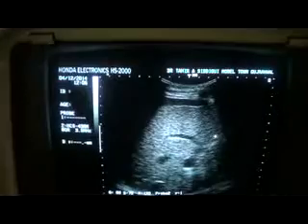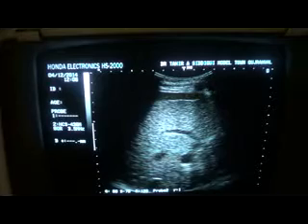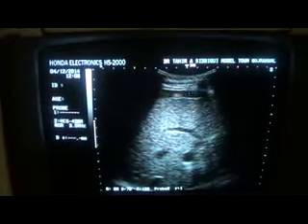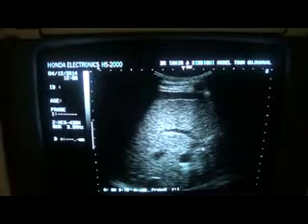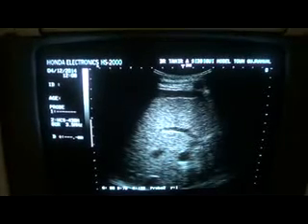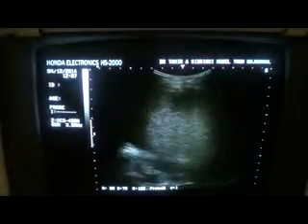Thank you very much. This ultrasound study is in fact to inform you that whenever the liver is being surrounded by ascitic fluid, as you can see here, this is the outer surface of the liver and this is the fluid surrounding it, the liver appears to have diffuse increased parenchymal echogenicity, whereas I can tell you that this is a normal liver. Now why is it appearing fatty? It is not fatty in fact.